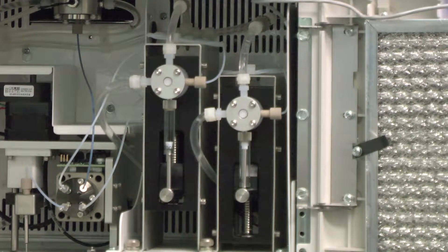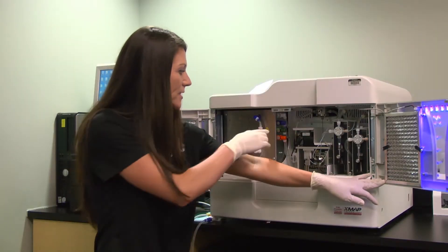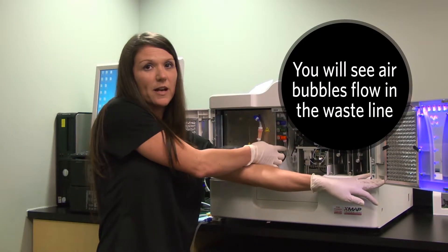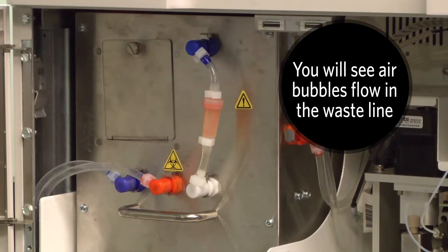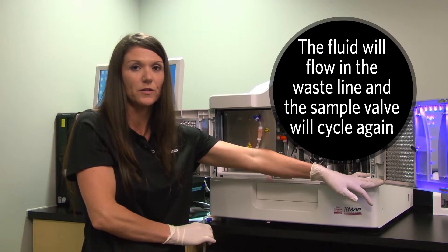Additionally, while the syringes are pumping, you should see fluid going to the waste. You'll either see the waste line here have air bubbles with fluid going through, or you'll feel the toggle of the waste going, or the fluid going to the waste.